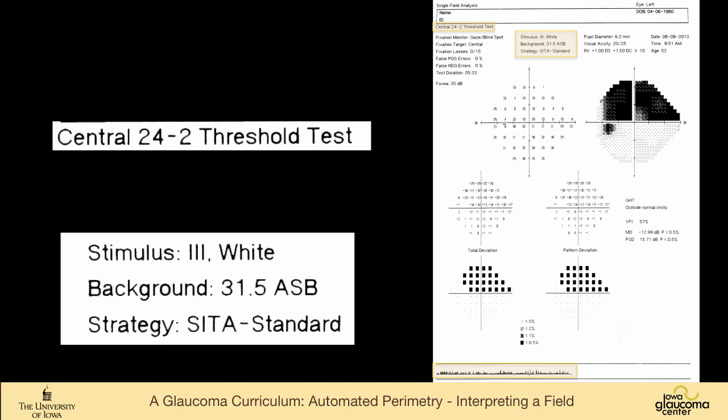It's a white-on-white or achromatic field. The background is 31.5 apostilbs. That's the normal background. That's not variable. It's in the Goldmann perimeter. So the test is done in a photopic way. It's not a dark perimeter, but the perimeter is illuminated. And the strategy here is SITA Standard.